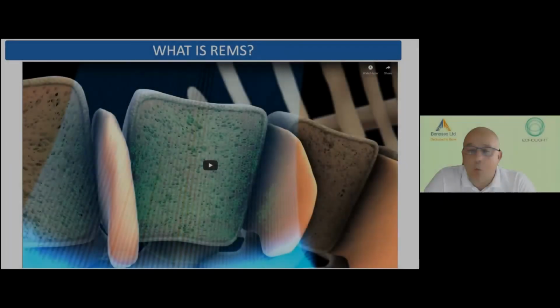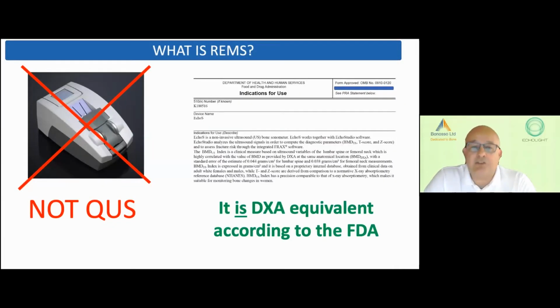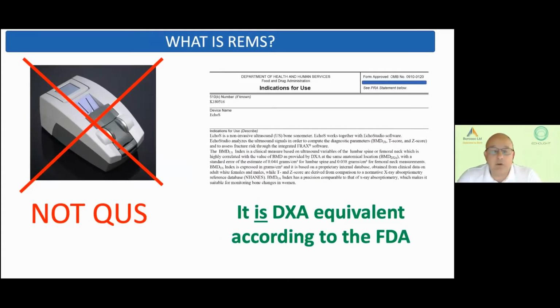So carrying on, what is REMS? Well, it's not to be confused with QUS, quantitative ultrasound. It is ultrasound. It is a totally new type of use of ultrasound in bone health and bone assessment, but not QUS, and that is what has been known in the past, and not equivalent to DEXA.